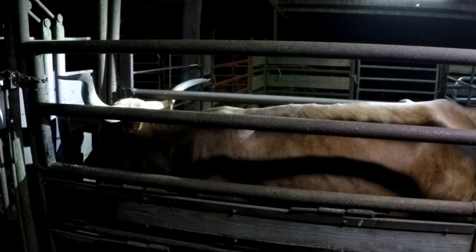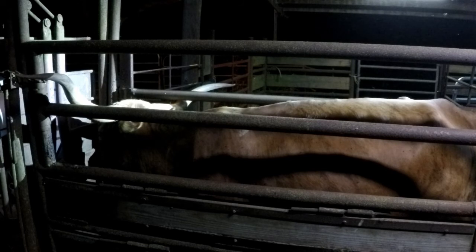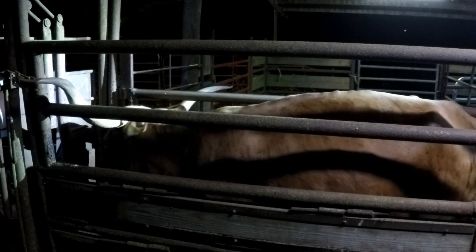Longhorn. Pop in with the left, working the gun with the right, up at an angle, moving forward. She's really pressing against me right now.